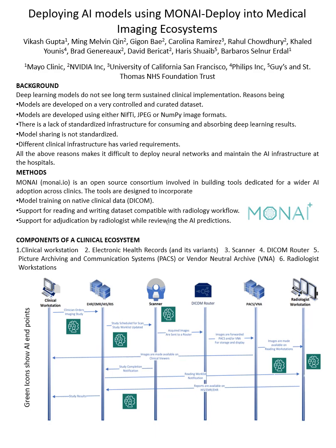Nowadays, there are more AI models that are developed, but very few of them reach the end user who are the patients and radiologists. The reason being that most of the models are developed and tested in a very controlled environment and with very curated data set. They fail to either perform at the same level of accuracy when deployed in a hospital, that is, if they are deployed. Plus, there is a huge overhead cost associated with such deployments.